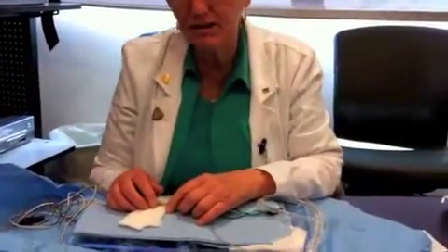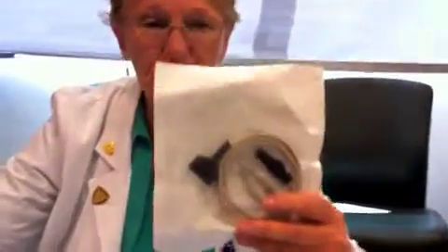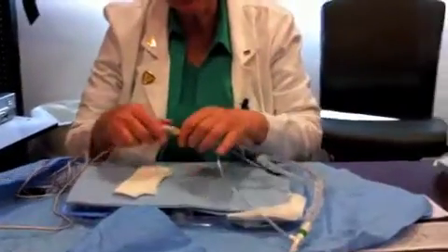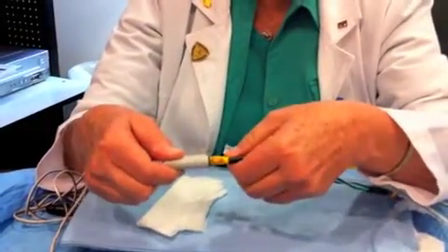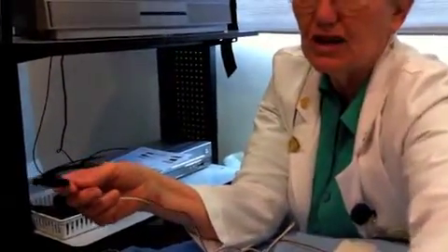Once the doctor gets that put in, he's going to ask for the pacemaker generator and the bridging cable. This is the bridging cable that you want — there are two other types of bridging cables, but you do not want those. You want this particular bridging cable. You're going to drop that into the sterile field, and the doctor is going to plug it into the pacemaker wires, putting negative on one side and positive on the other side. Then he hands you the bridging cable so that you aren't touching him and the area stays sterile.